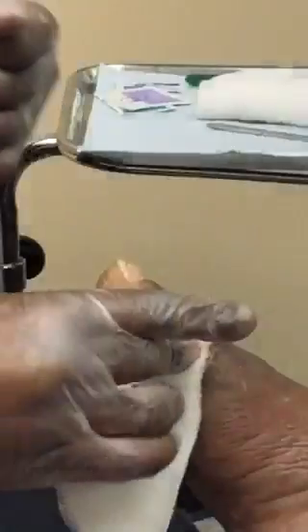Go ahead and open it up, we'll get a better look. There it is. So that's the graft — we're using a two centimeter by two centimeter graft here today.